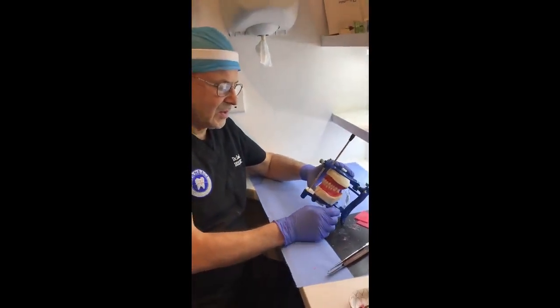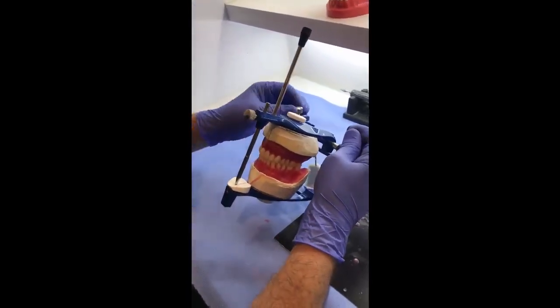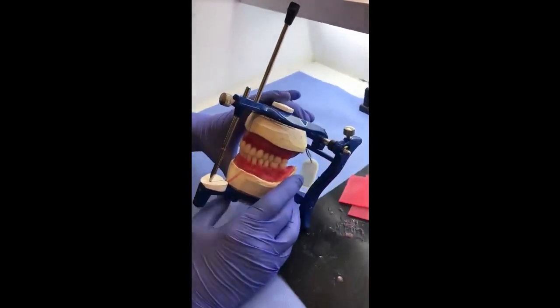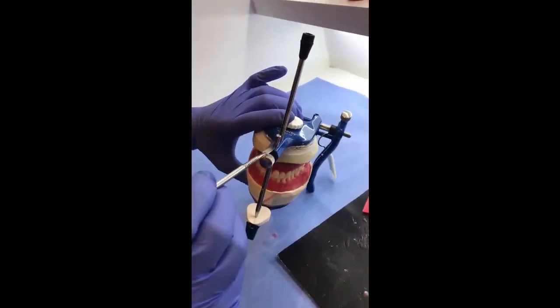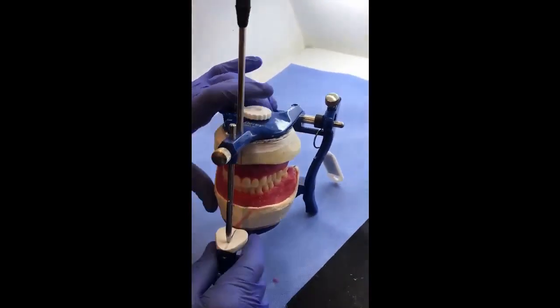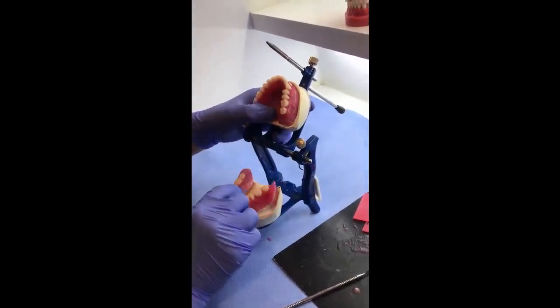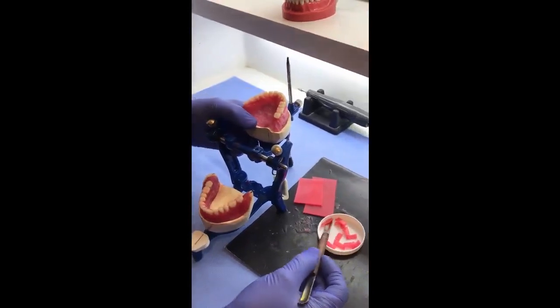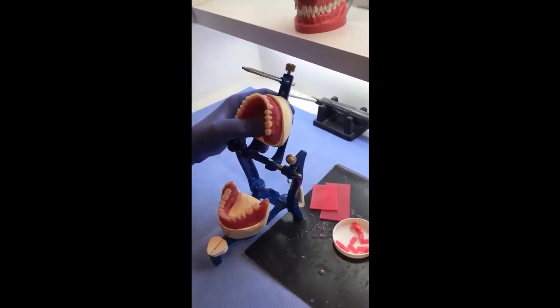Now the first step in waxing up the trial denture is to close the articulator at the centric relation. These centric stops must be closed, so there is no movement of the articulator except opening and closing. We check the zero line of the incisal pin and the touch with the incisal guidance table. Now after that, the next step is to seal the trial denture to the cast. Now we use the base plate wax to achieve this sealing.